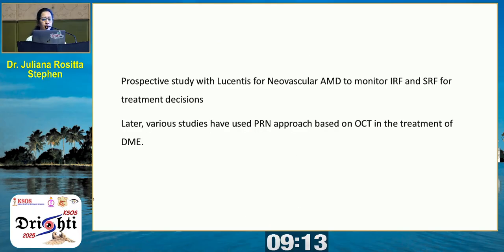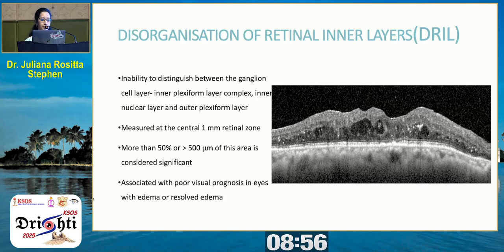The role of OCT was first established in the prospective study with Lucentis for neovascular AMD to monitor intraretinal and subretinal fluid for treatment decisions. Later, various studies have used PRN approach based on OCT in the treatment of diabetic macular edema.